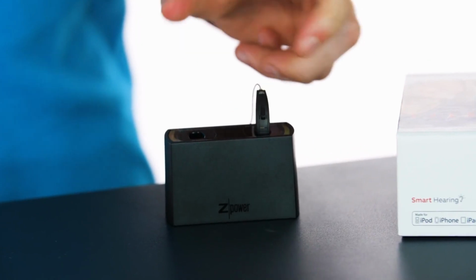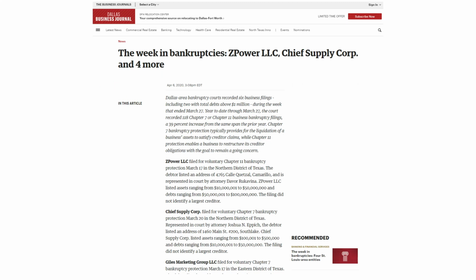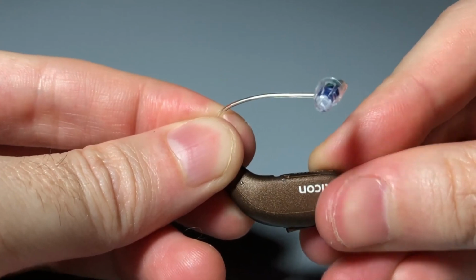All right, so I made a rechargeable video back in 2018 and here's where things stood then. At that time, if you wanted rechargeable hearing aids, you had two options. You could use the silver zinc system from Z-Power or lithium-ion rechargeable batteries. The Z-Power system was awesome because it let you have the best of both worlds. You could use their rechargeable batteries and at any time switch to using disposable batteries. But it just didn't end up working out well. Z-Power filed for bankruptcy, and in the last few years, all manufacturers have switched to using lithium-ion batteries for their rechargeable hearing aids. So what you have to decide between now is, well, simpler in a way. Do you want lithium-ion rechargeable hearing aids, or do you want to use traditional disposable batteries? So it's one or the other now.